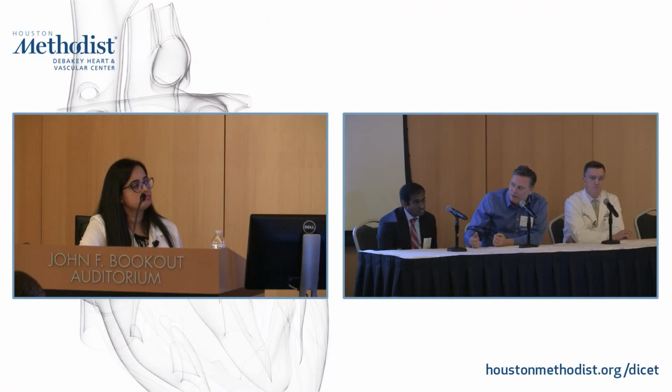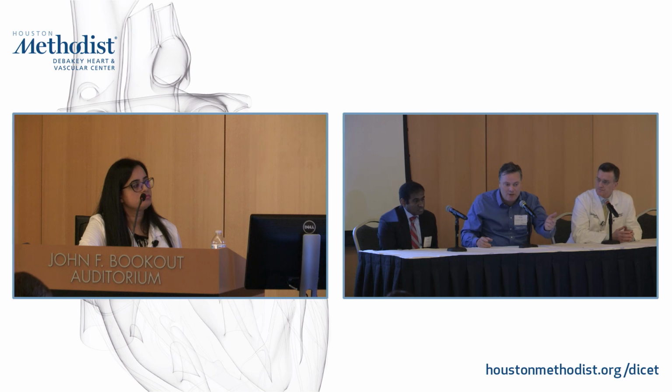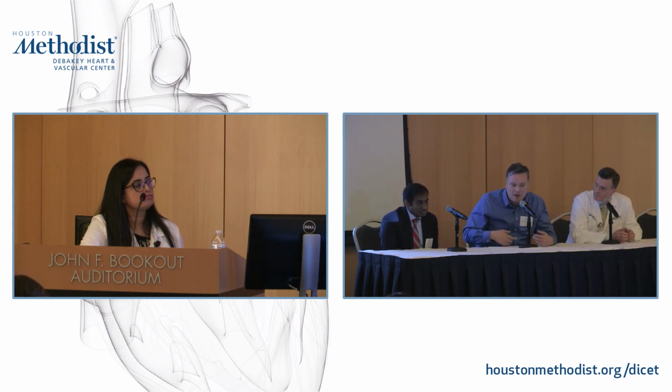So we're in the cath lab, right? You already have technically a vent in the LV, so you're venting the heart as best you can, even though you still have a high wedge. You could put the patient on peripheral ECMO, and the only reason that's not going to be your permanent solution, but what that would do is give you some breathing room, some time to stabilize that patient, and then figure out where you're going to go from there. Otherwise, you sit them over in the ICU, and they start to deteriorate, they get acidotic, and then you're way behind the 8 ball. Right.